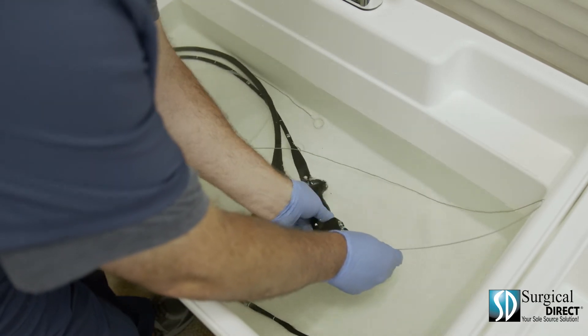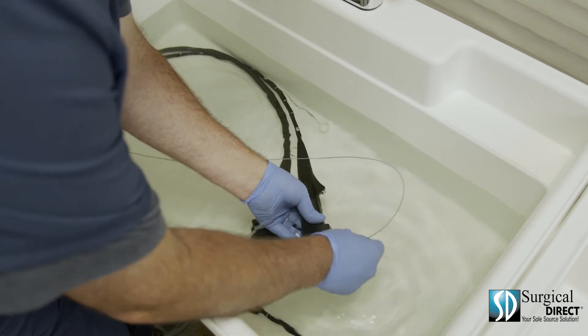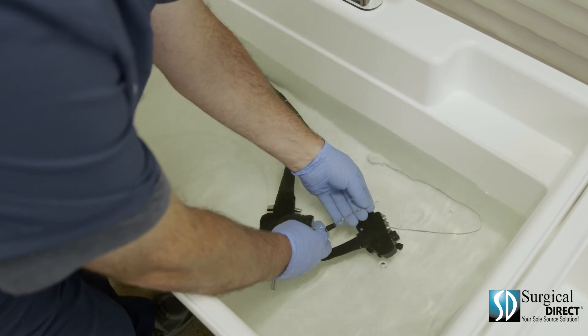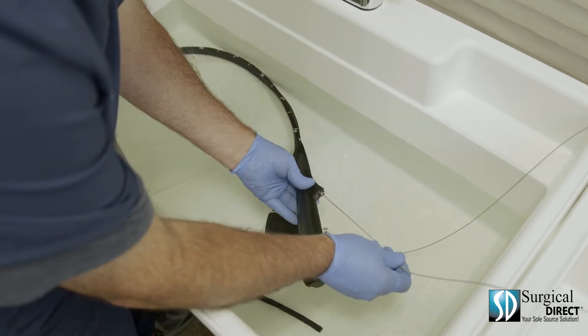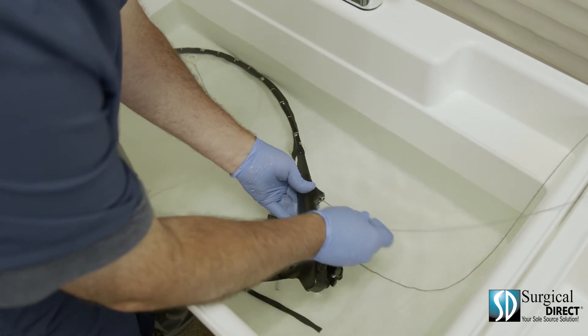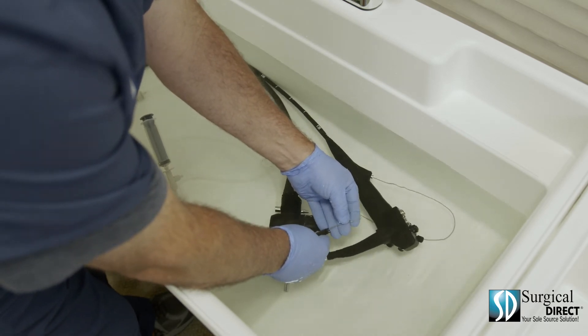Next, at a 45-degree angle, advance the brush down the suction channel of the insertion tube. Be sure the bristles are clean and repeat this step for a total of three times. Lastly, insert the cleaning brush in the biopsy channel and be sure that it comes out clean. Repeat this step three times as well.